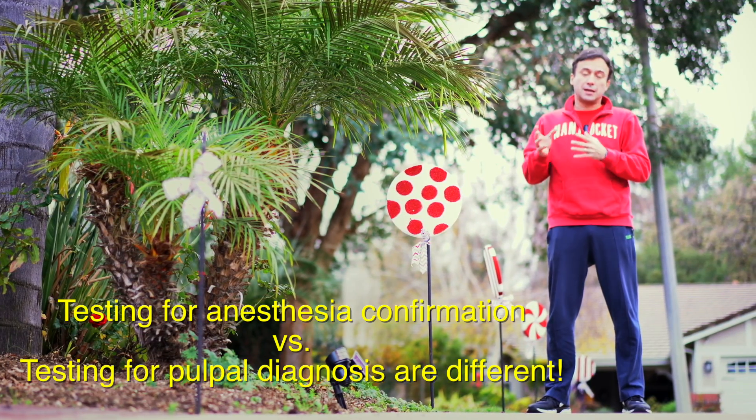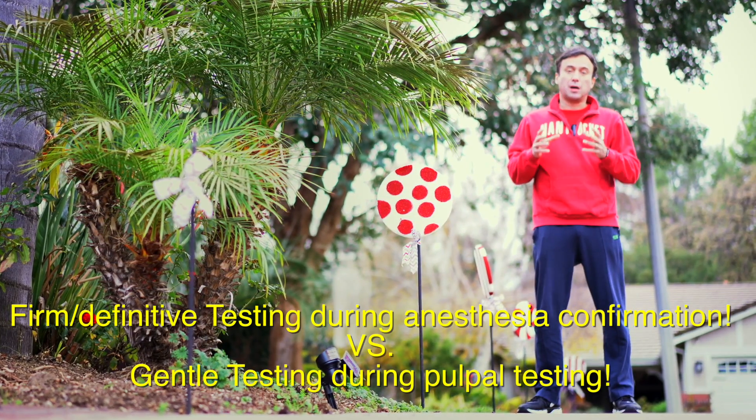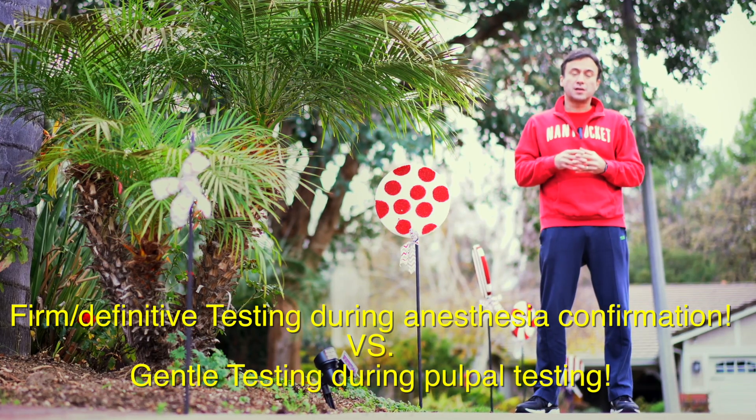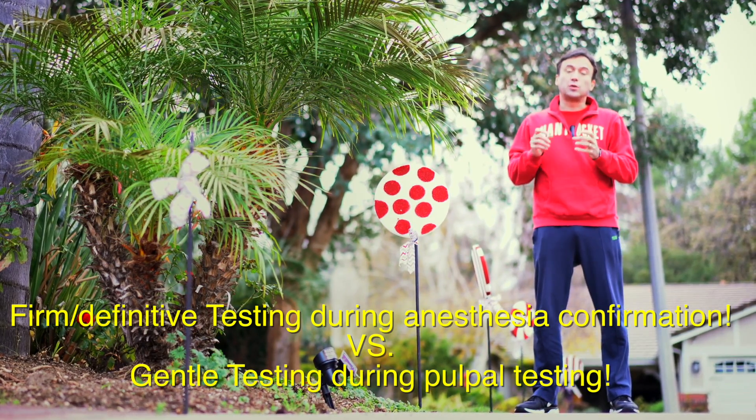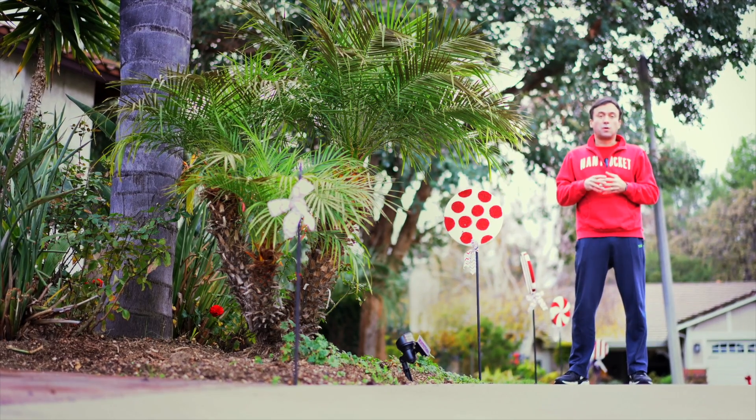For anesthesia confirmation, at that point you really want the maximum kind of response. A cotton pellet is a better means of conducting the cold rather than a Q-tip, which doesn't get quite as cold.